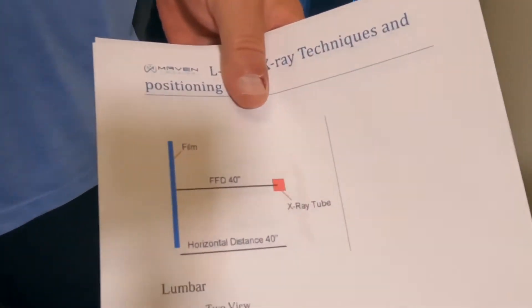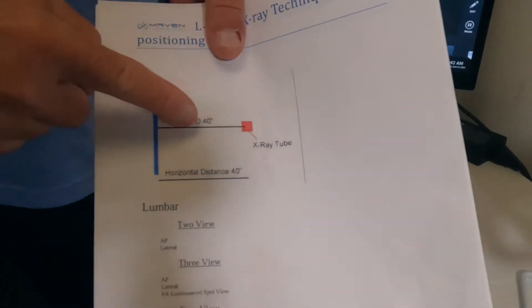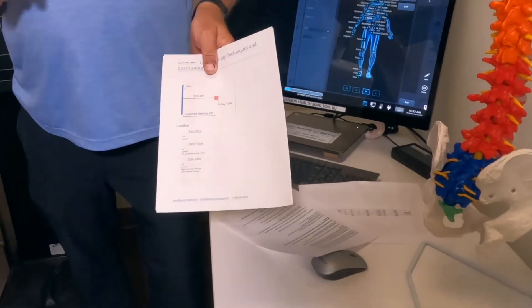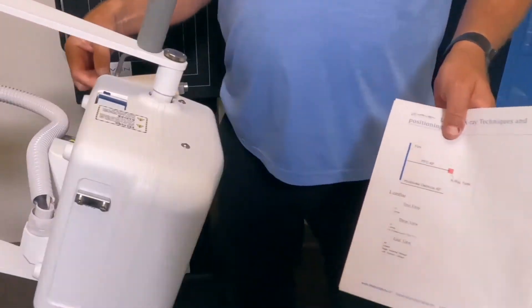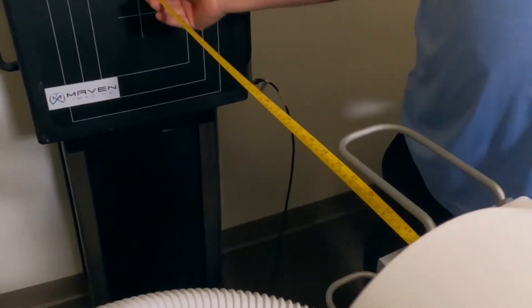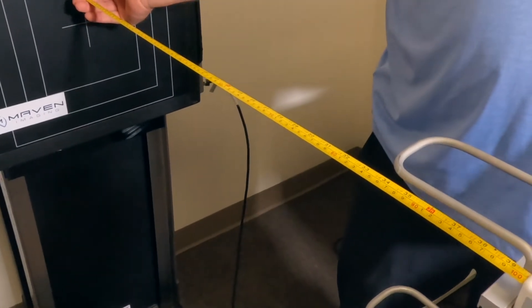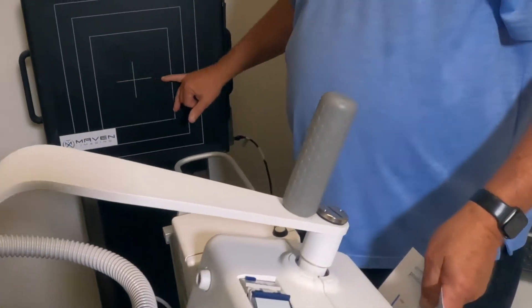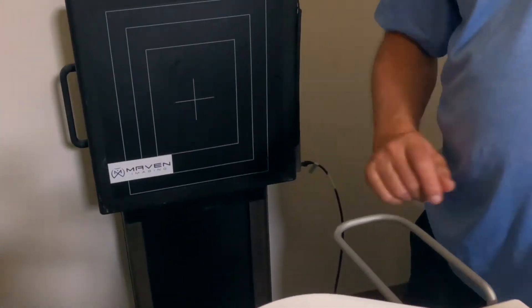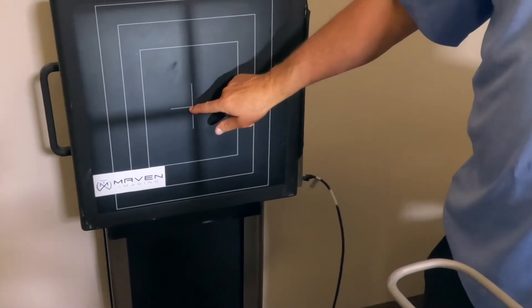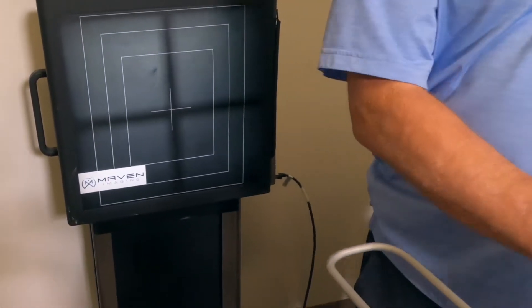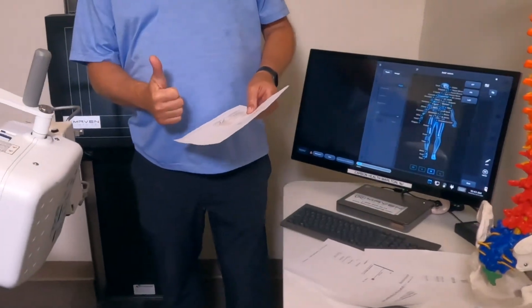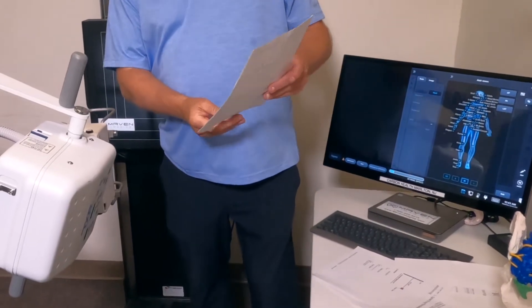To take an L-spine shot, you set the x-ray to be at 40 SID. You take the tape measure and run it to the DR panel at 40 SID. What you do is align this image as you can see with the crosshairs of where we're going to take the shot. We're going to do an AP shot and a lateral shot.